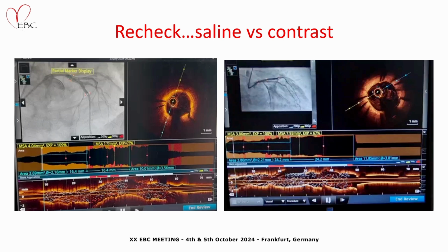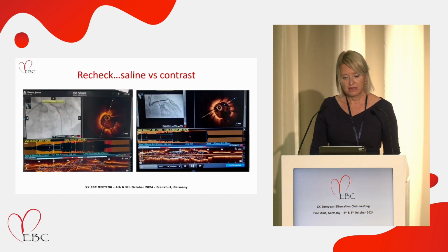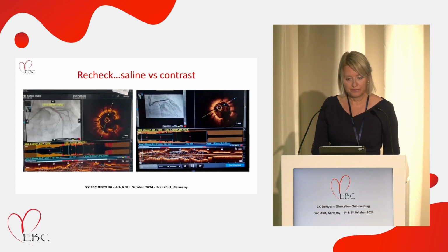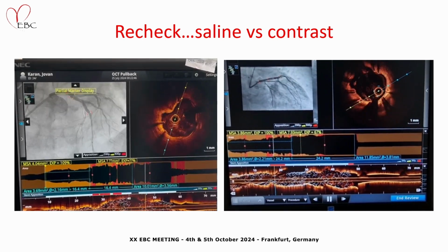We spoke a lot about saline, especially my friend from Lucerne, he enjoyed saline so much. So I tried to use the saline and the contrast, and so this is the result with the saline. There is lots of blood, but it is readable. And this is the result with contrast. It's a much better picture.